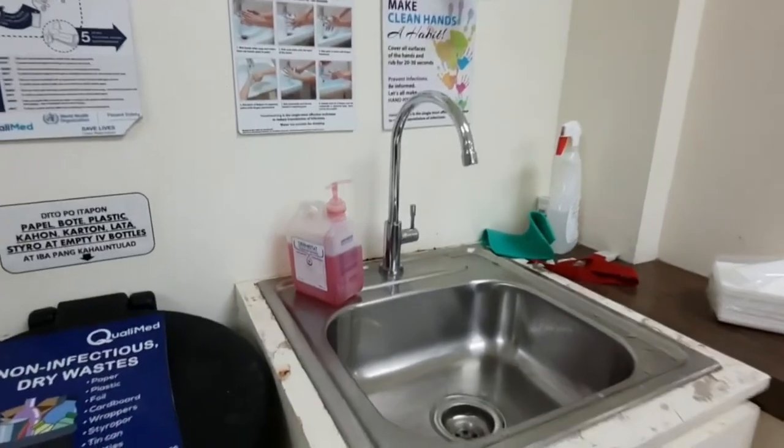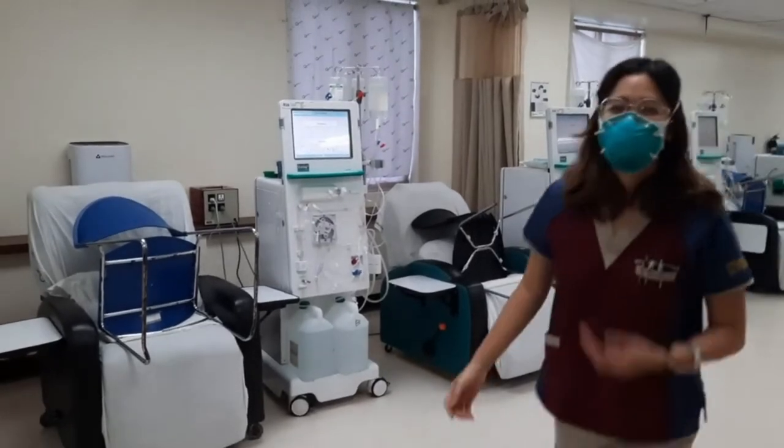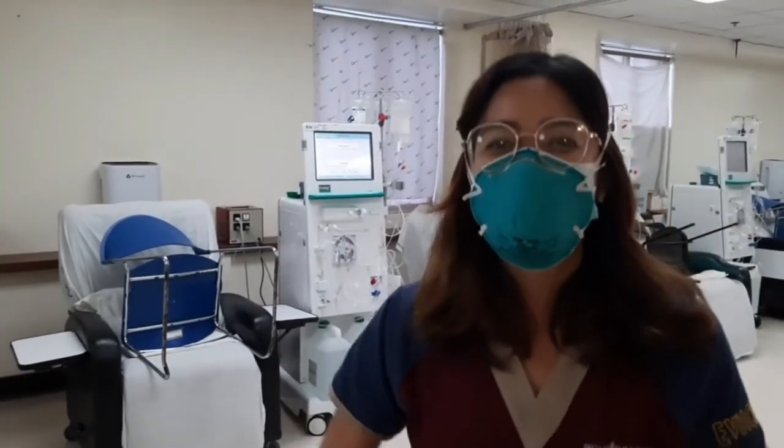It's best if they would wash their arms and hands before the procedure. And then they will sit on these chairs beside the HD machines.